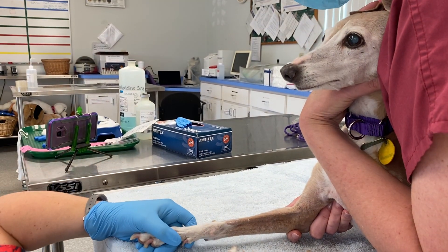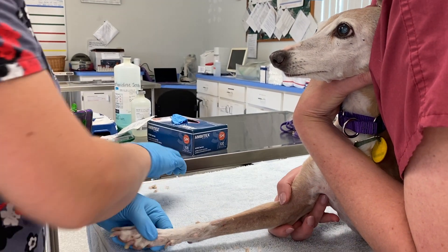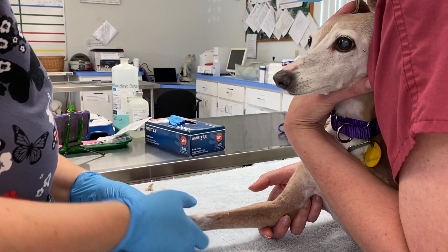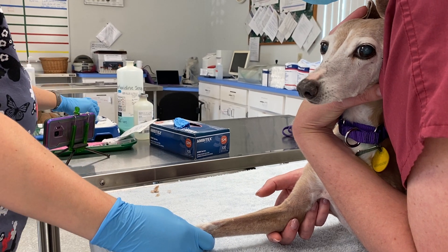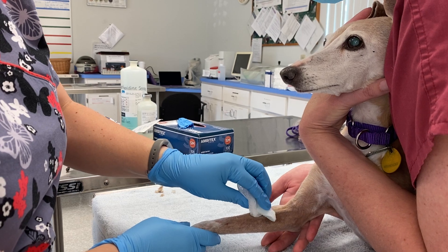You don't want to take a long time because that tends to freak them out too. If you notice, my holder's not exactly holding off the vein yet, but they're in position — it's because you don't want to occlude the vein for a long time.